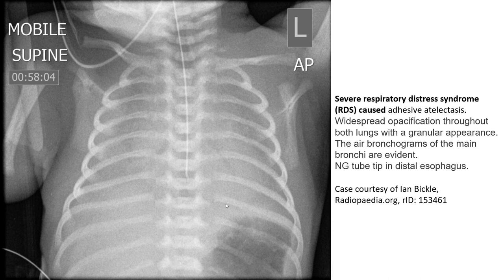This results in widespread opacification throughout both lungs with a granular appearance. The air bronchograms of the main bronchi are even evident.